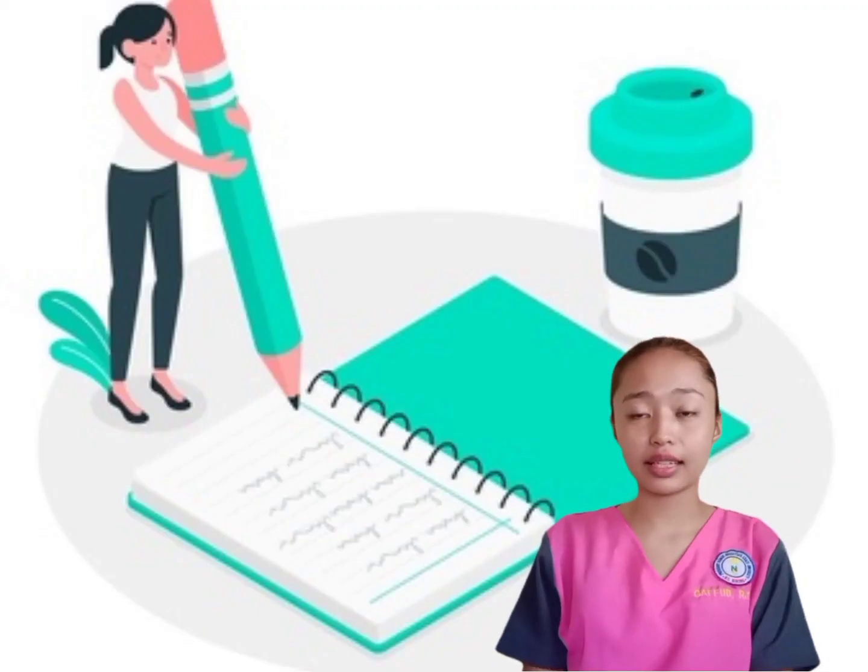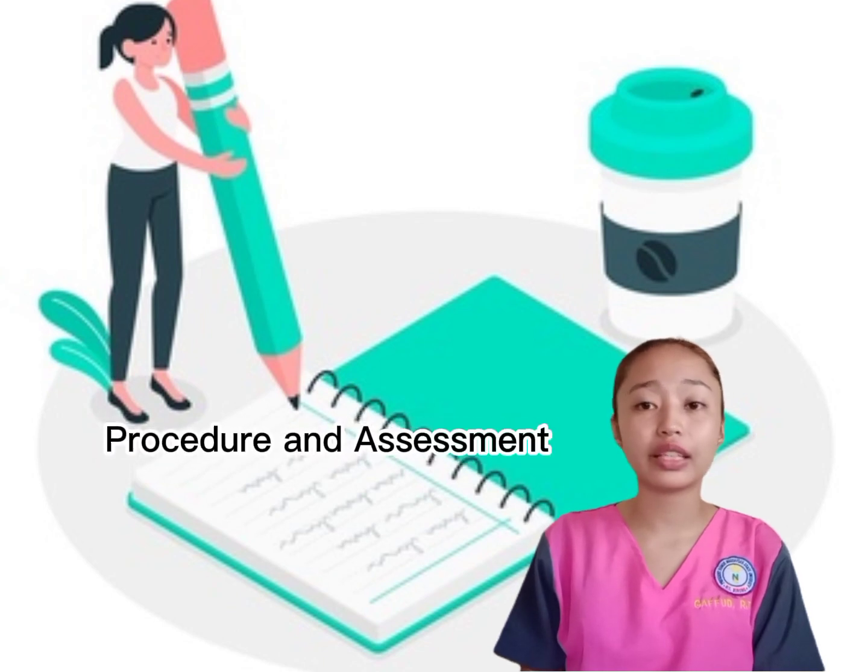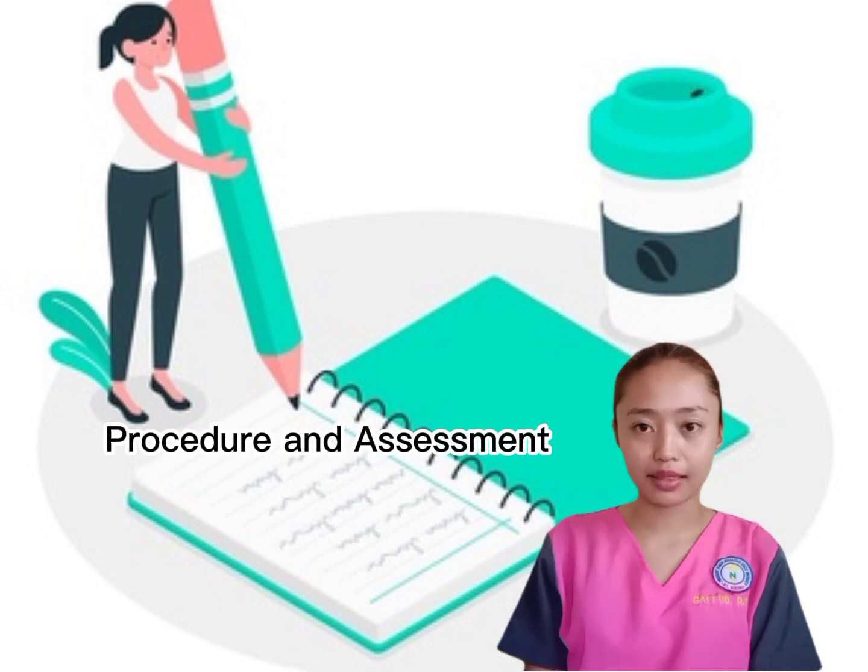Last but importantly, document the procedure done, including the amount and description of the return upon suctioning and any other relevant assessment. Let's end our video.